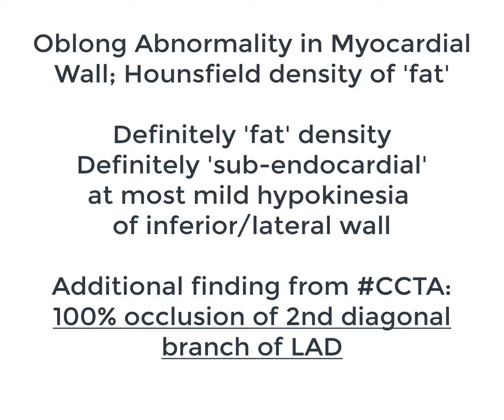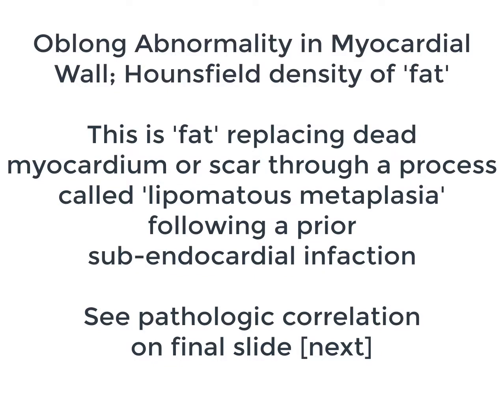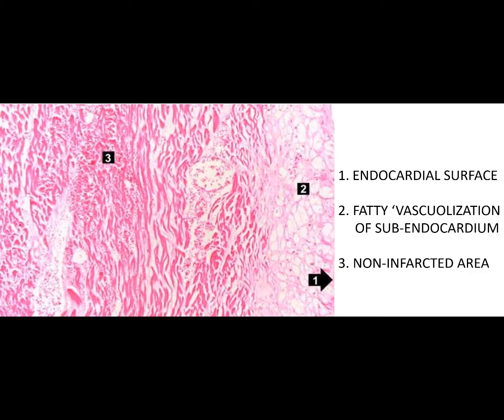This is definitely a fat density, definitely subendocardial, and at most mild hypokinesia. Additional findings also showed 100% occlusion of the second diagonal branch of the left anterior descending coronary artery. This is fat replacing dead myocardium or scar through a process called lipomatous metaplasia following a prior subendocardial infarction. Here's the pathology of this. You can see the endocardial surface with the fatty vacuolization of the subendocardium in the same region, and then normal myocardium in the subepicardial region.